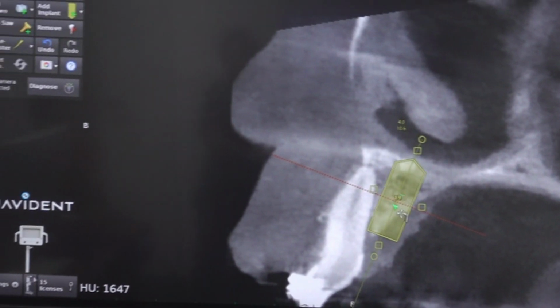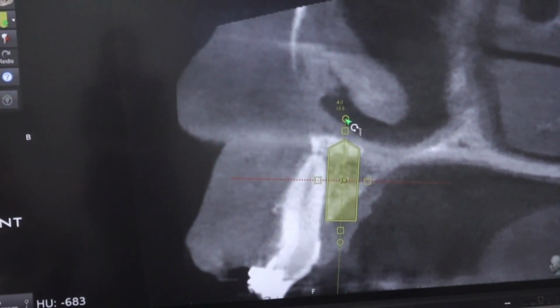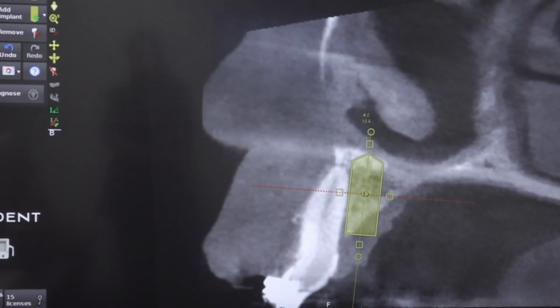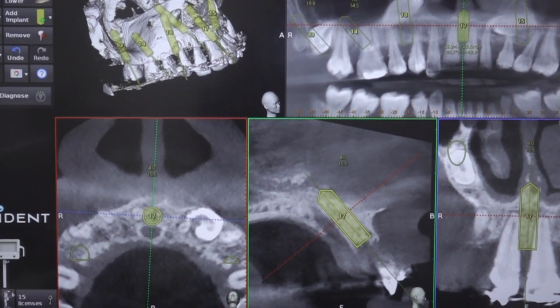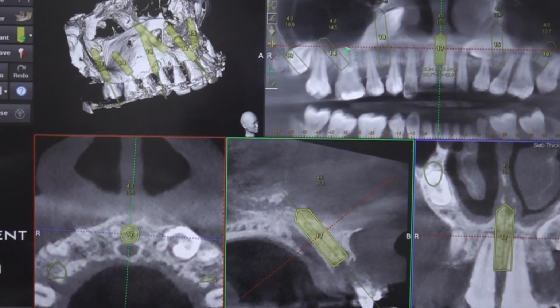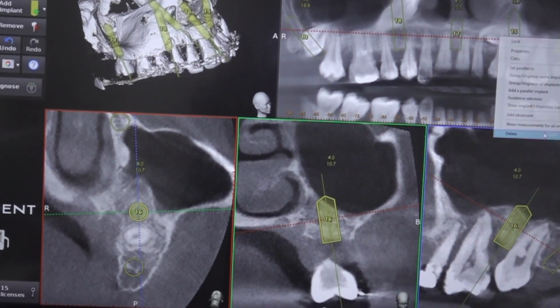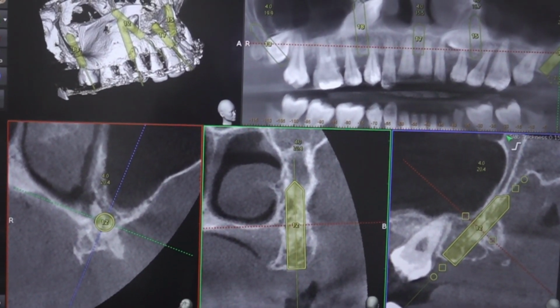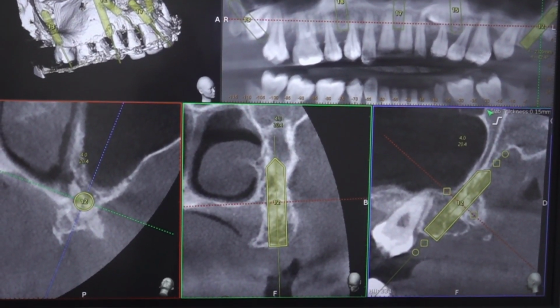Maybe we can do some parallel approach like this. But this is enough. If you place this, getting good decent stability, actually we don't need this intermediate implant also. These 5 implants are more than enough, provided all are good. All are 5. So we'll see.